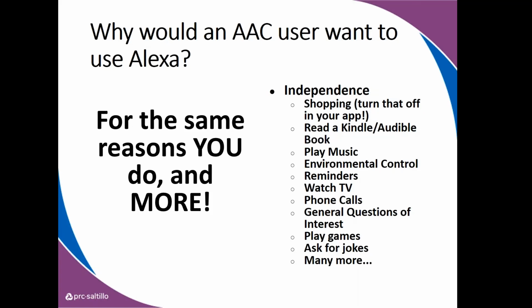And yeah, play games. I'm going to give a quick note here because we're thinking about Alexa at home with parents. I have elementary age children. I make sure in my Alexa app that I cannot shop with Alexa because a lot of interesting things would come to my home that have been purchased. And AAC users are known to purchase some things too, intentionally or accidentally. So I don't shop using my Alexa, although I have many adults that I work with who do. All right, does that make sense? Okay.